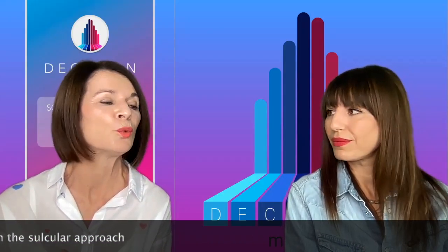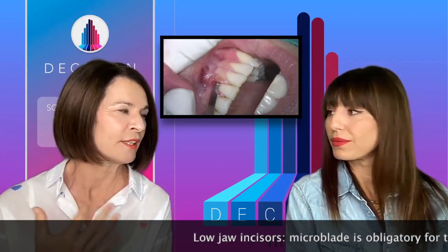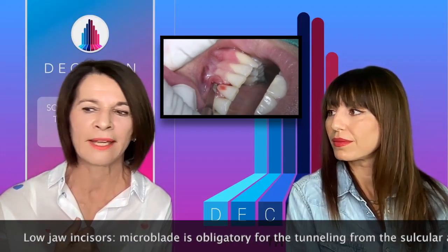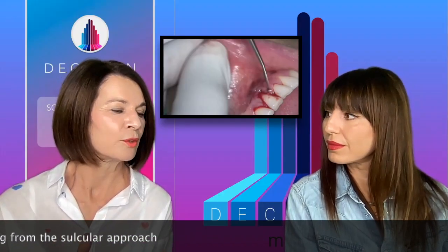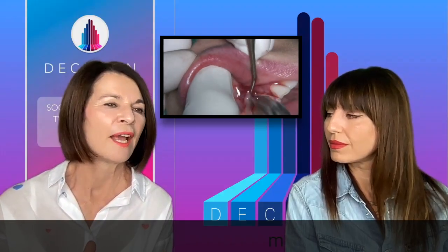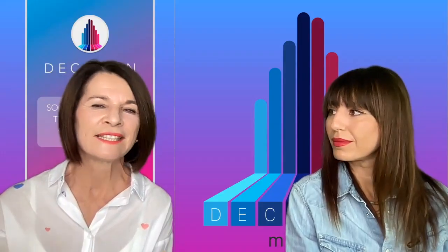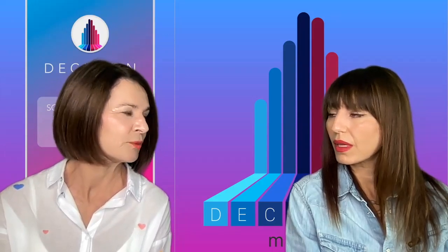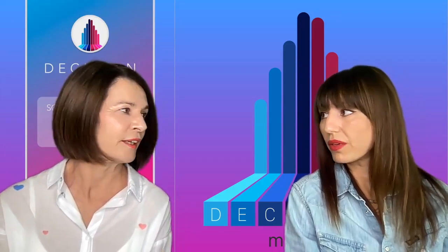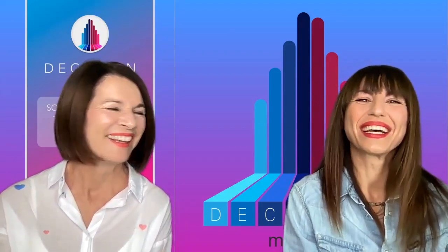For this reason, we utilize microblades, at least a 15C blade. For the lower jaw incisors, it must be a microblade. And the risk of cutting or destroying the sulcus is less. But if the keratinized gingiva is really 7, 8, 9 millimeters, it's really, really hard to dissect it coming solely from the sulcus. Yes, and you can perforate it.